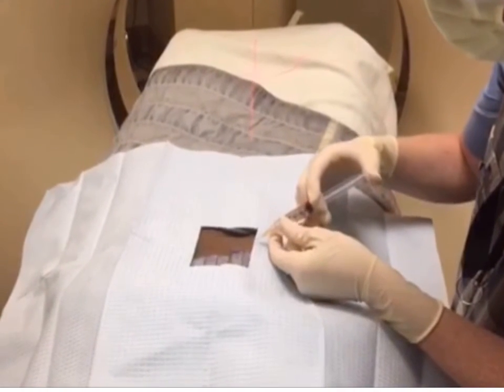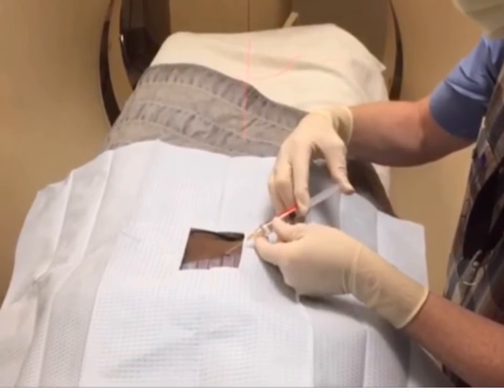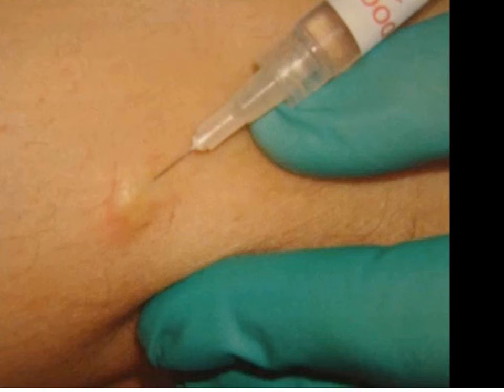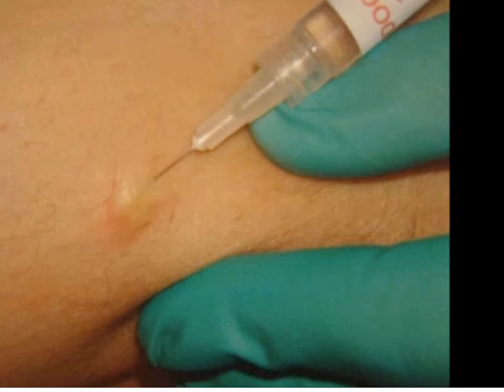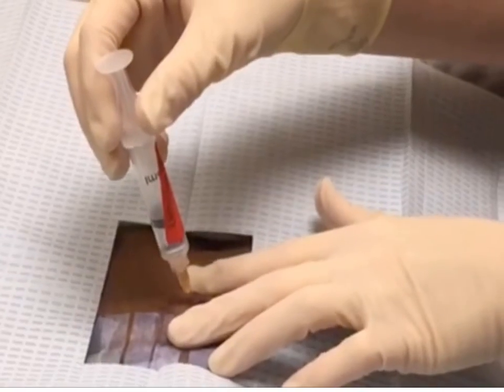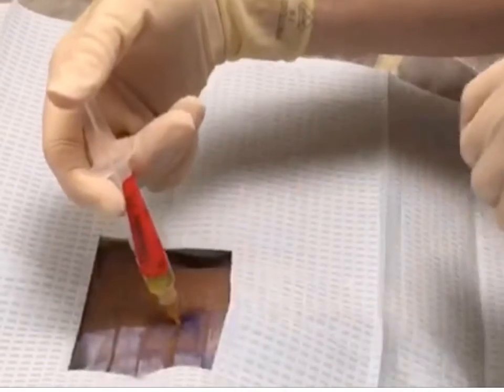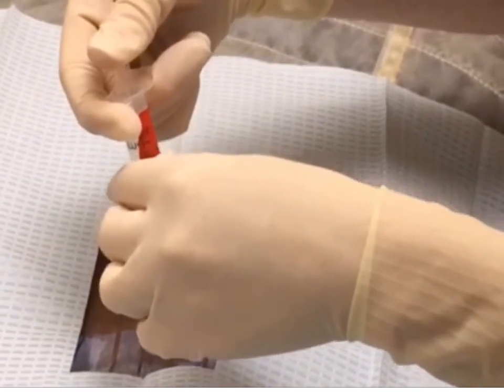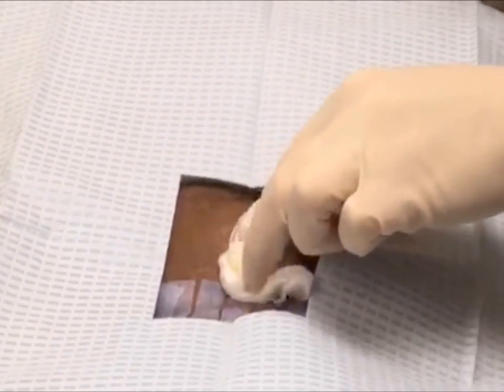Once the approach to the fluid collection has been determined, local anesthesia is given using 1% lidocaine. First, a small subcutaneous skin wheal is created by injecting the lidocaine into the dermis. Afterwards, the deeper soft tissues are infiltrated. It is important to apply suction to the syringe prior to injection to avoid accidentally injecting into a blood vessel. Once the patient has been sufficiently anesthetized, make a skin nick a couple of millimeters deep.